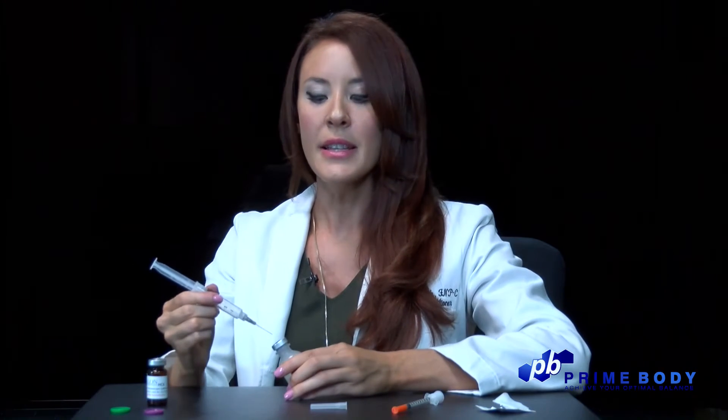Next, using your mixing syringe, you will inject 5 milliliters of air into the bacteriostatic water vial. This creates a positive atmospheric pressure in the vial and allows the solution to flow out more easily.